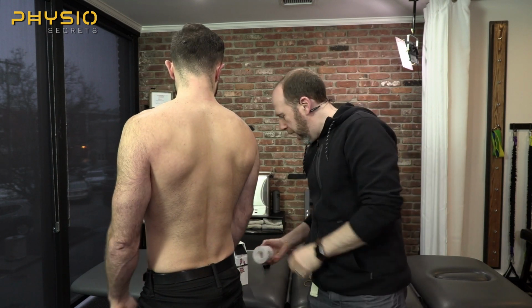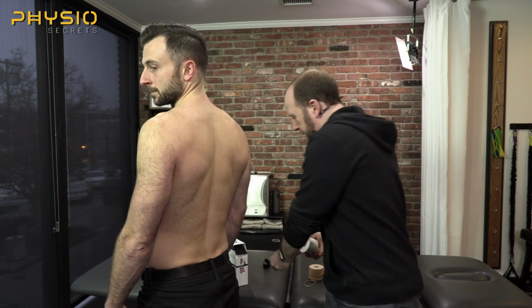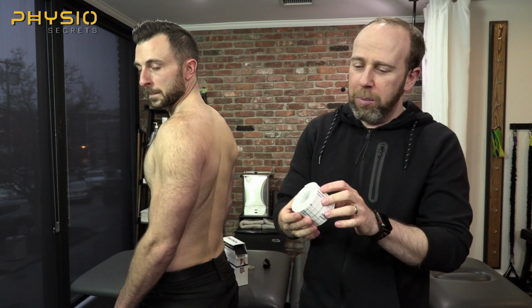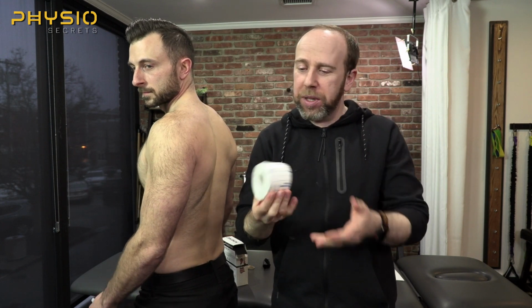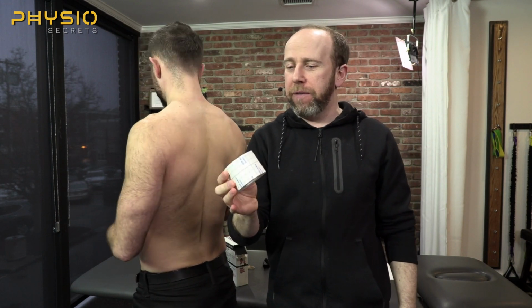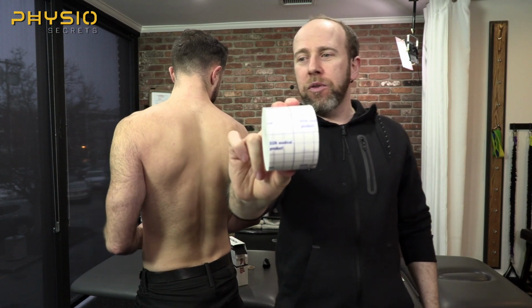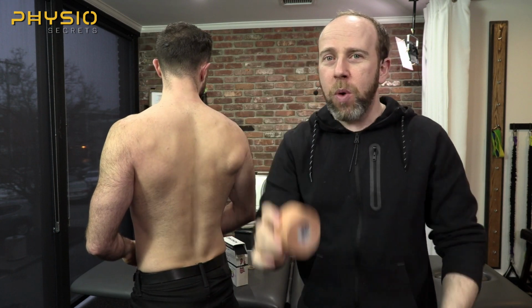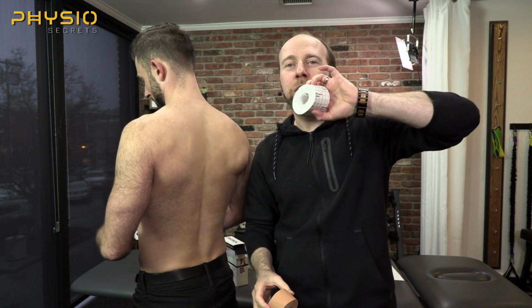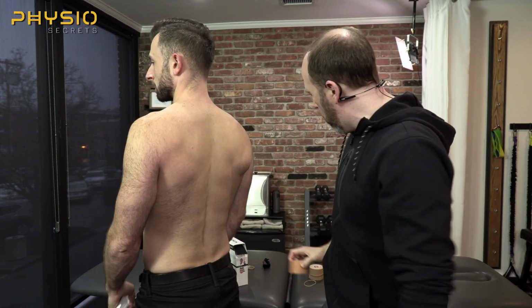What I prefer instead, and I have really not seen very many physios using this, but this is an absolute hack and probably one of the best hacks with tape I've ever figured out, is cover roll. This is the same cover roll that you would use underneath Leuko tape. But guess what? I use cover roll with almost every single tape job, and I almost never use Leuko tape, and you are going to see why.